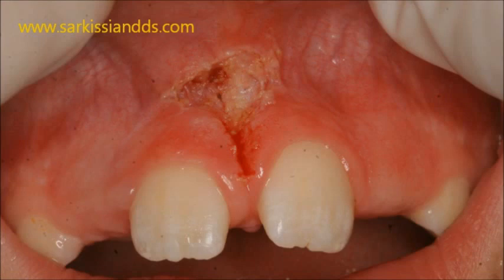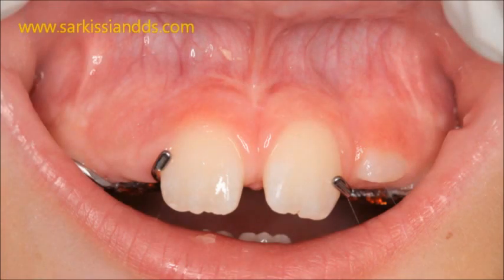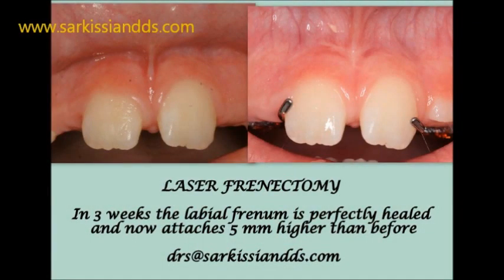As you see, this absolutely tissue- and child-friendly procedure took only a few minutes. Healing time is shorter than usual and the discomfort is amazingly negligible. Pain medication is not even needed post-operatively. This is yet one more example of cutting-edge laser dentistry.